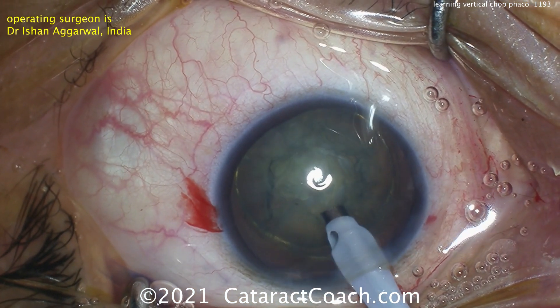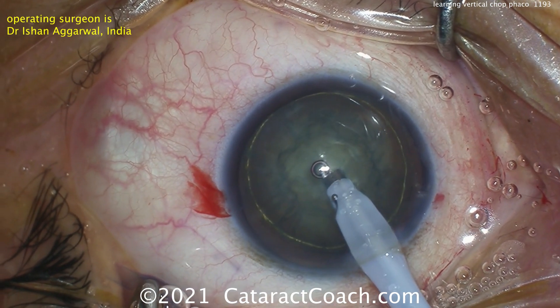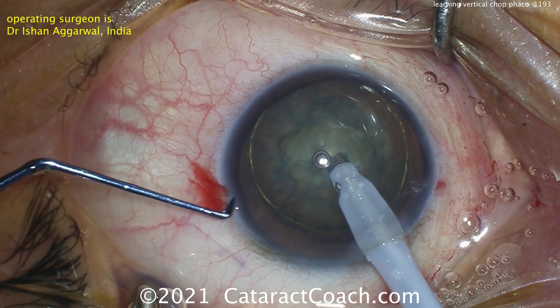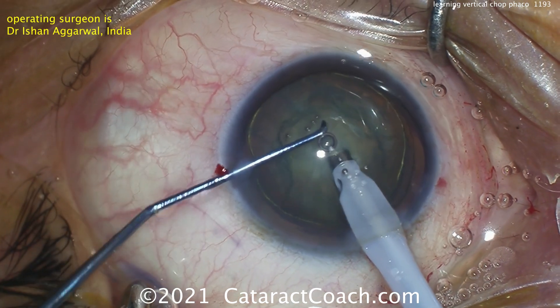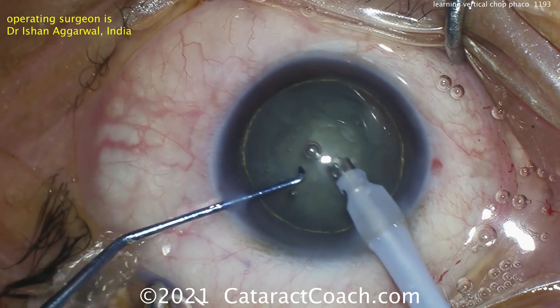Let's see the technique. Getting nice and deep into the nucleus here. You need to get that tip occluded if it's a peristaltic pump, which most of these are. And now going in with the chopper. It's relatively sharp compared to the other choppers. You need to get that vertical chop done.